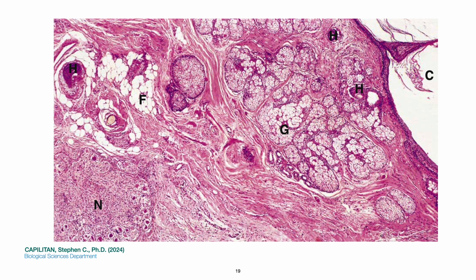A benign teratoma of the ovary is shown in this micrograph. Epidermis-type epithelium, including the hair, is seen here.